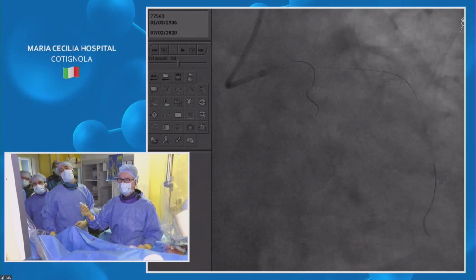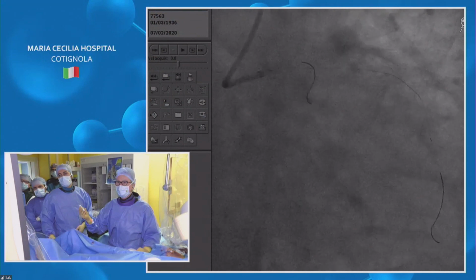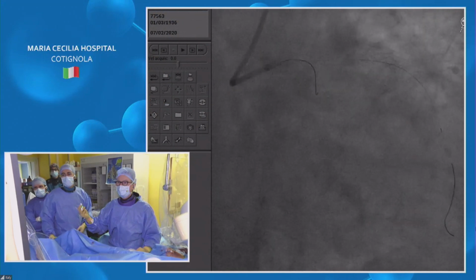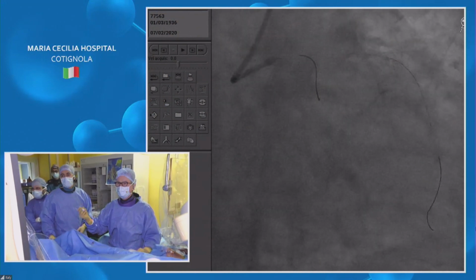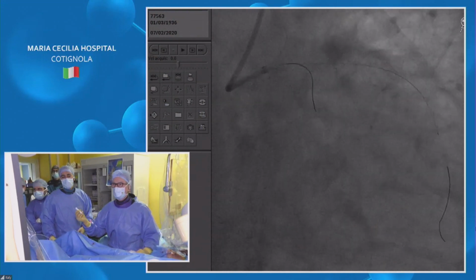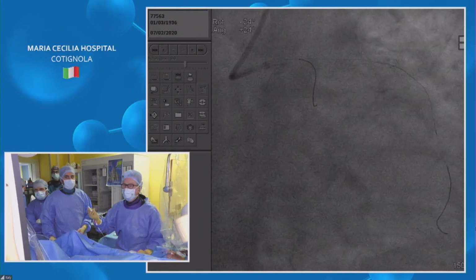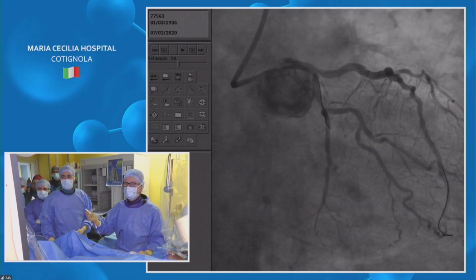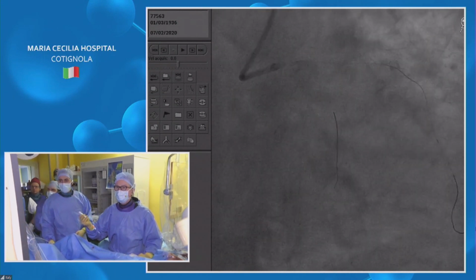So here your goal would be to go into the big marginal. I think, or even, yeah, let's go in the big marginal. Makes more sense. You want to change projection? Maybe okay, we need another angle. Let's take a picture. He's gone past it anyway. Let me show distance there. Maybe if it's positive there, it's fine enough. I can go with the other wire.